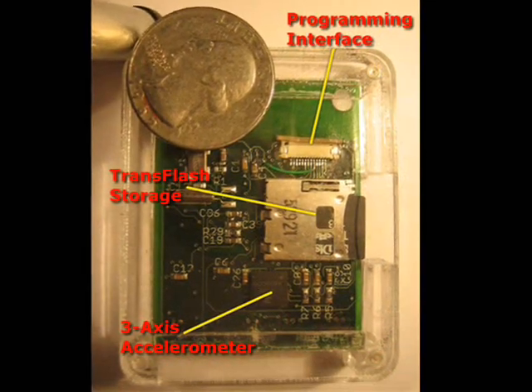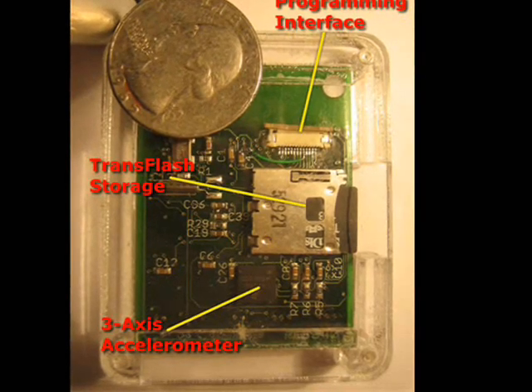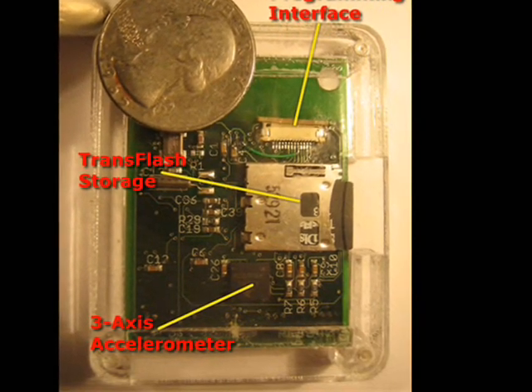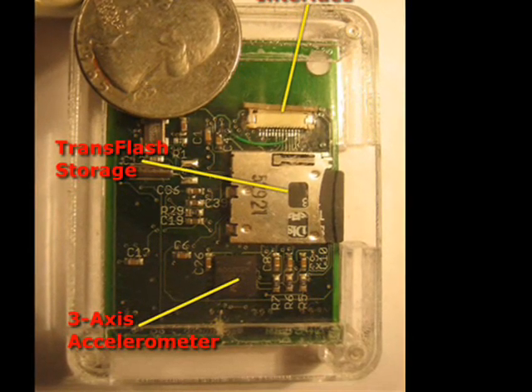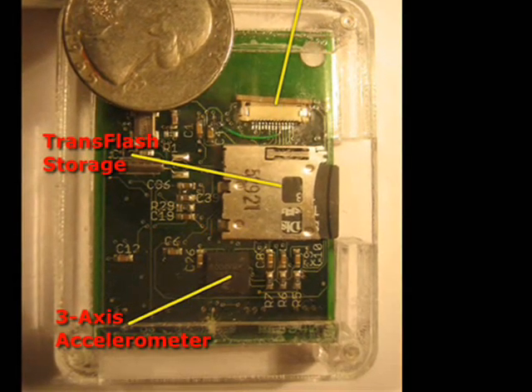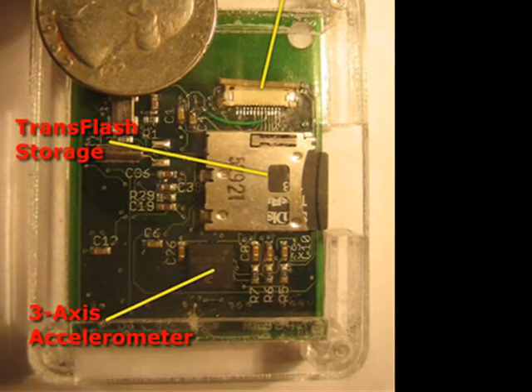The back side is populated with a trans-flash memory socket where data is stored to a FAT16 file system for easy access. You'll also find a Freescale 3-axis MEMS-based accelerometer that can be used to detect the user's body orientation, their activity levels, or even detect a fall. Finally, you'll notice a 13-pin programming interface.